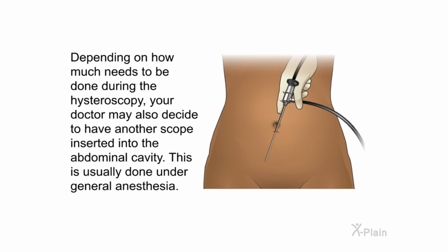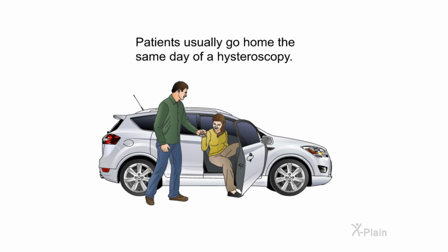Depending on how much needs to be done during the hysteroscopy, your doctor may also decide to have another scope inserted into the abdominal cavity. This is usually done under general anesthesia. Patients usually go home the same day of a hysteroscopy.